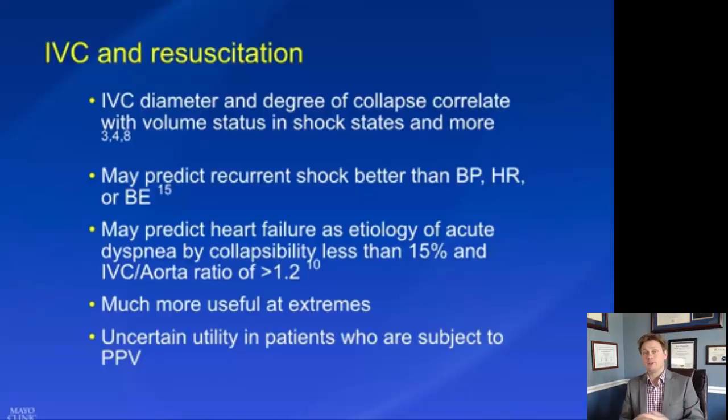And it has very many limitations. Again, people who are on positive pressure ventilation, people who have tricuspid regurgitation, pulmonary hypertension, a variety of other factors are going to limit its usefulness, but it's a good starting place.